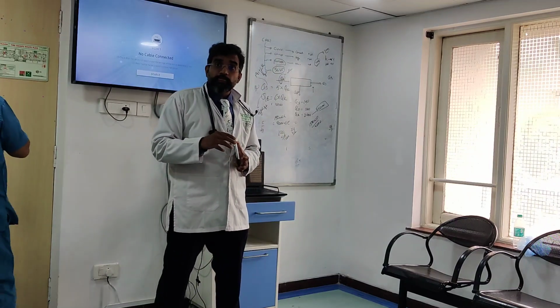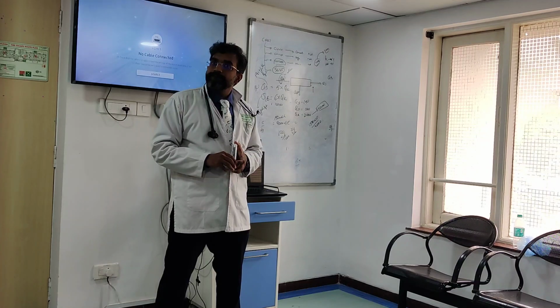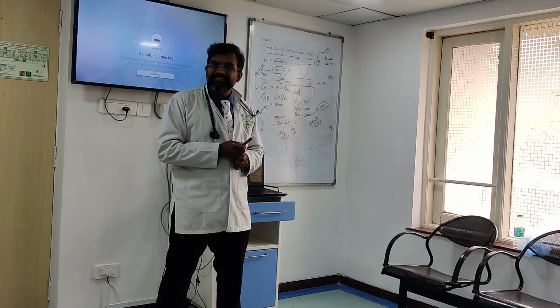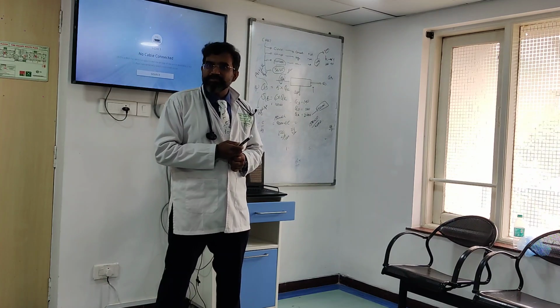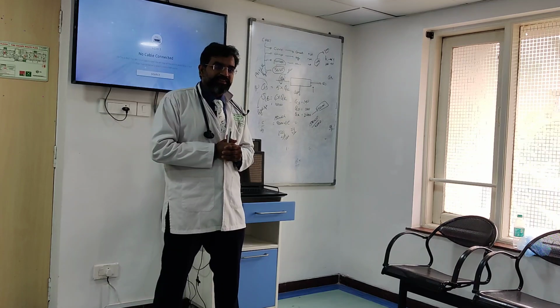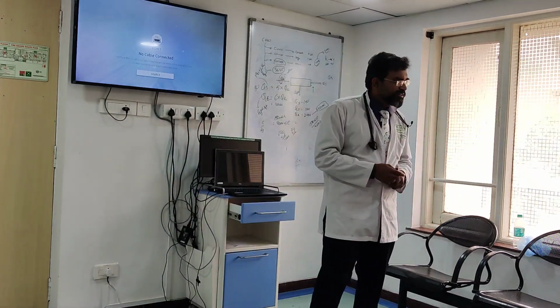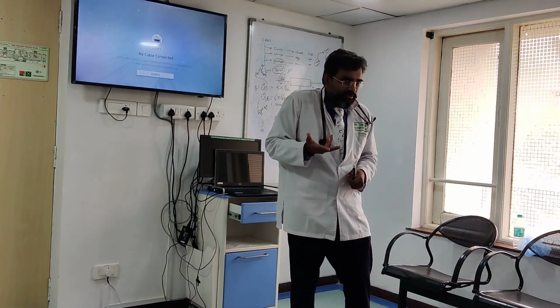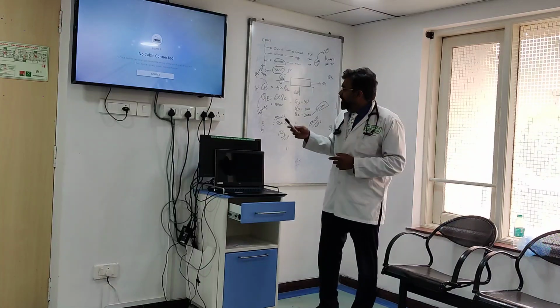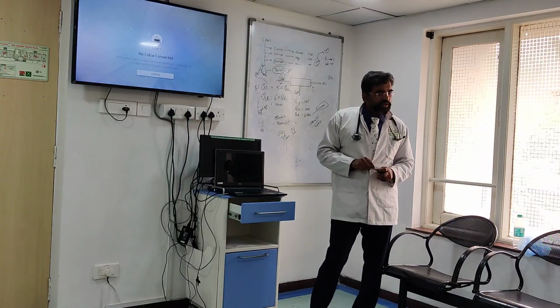Now, 5 times. The blood pump flow, it has reduced, no? Earlier it was 6 times, yes. Now you are giving 5 times the replacement fluid. You understand? And why are you reducing it? Because actually blood is going without getting diluted. So I don't really require so much flow. Understood? It's going without being diluted, so you don't require so much flow. So by doing this much, you will be able to do most of your CRRTs. Most of your CRRTs you can manage.